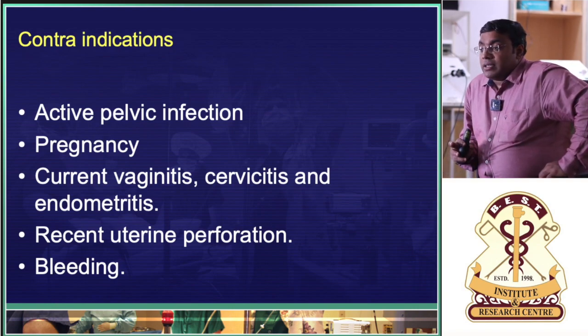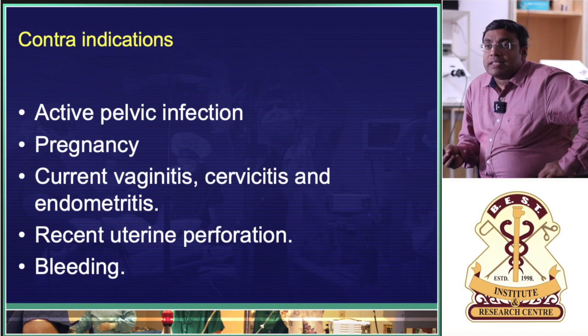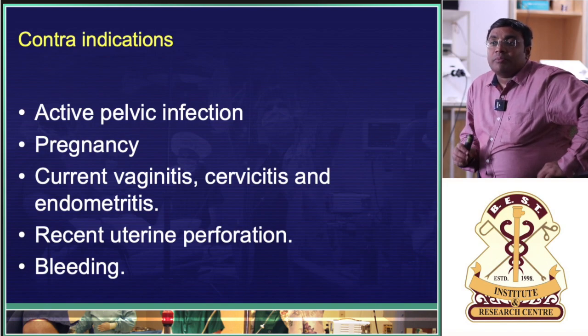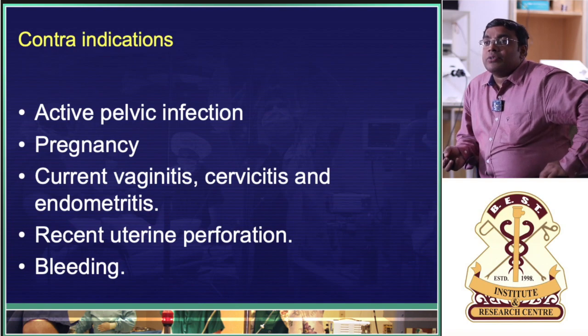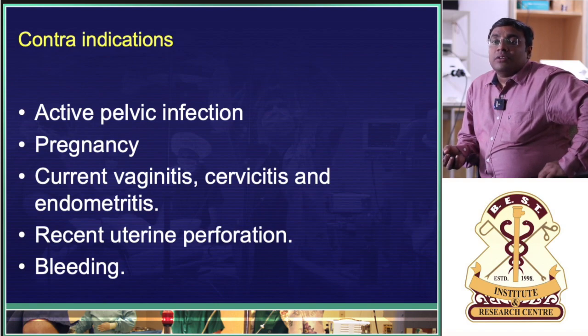Suppose the patient is bleeding, a D and C has already been done once, and you don't know what exactly the problem is inside. You will not post her again for the same procedure like D and C if your medicines don't stop the bleeding. In that case, you have to use a diagnostic scope which has an inner sheath and an outer sheath.